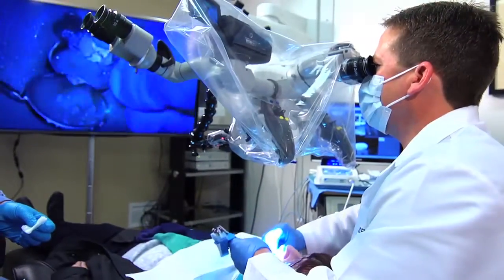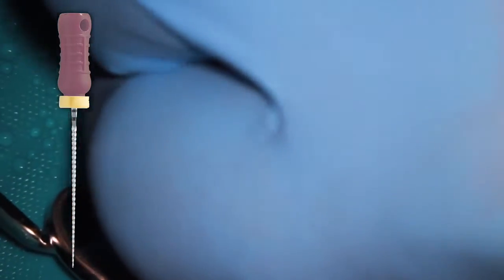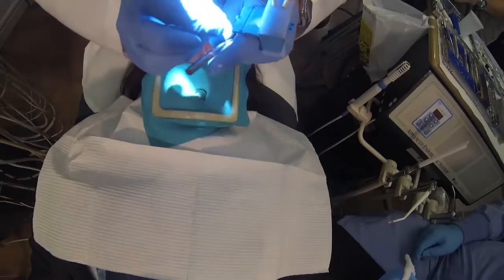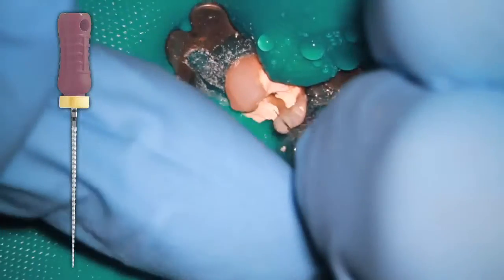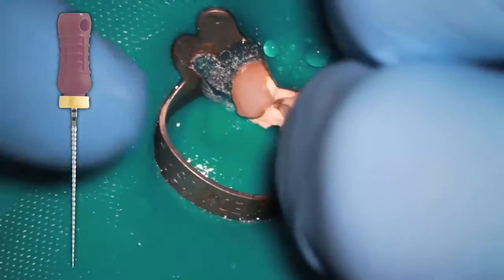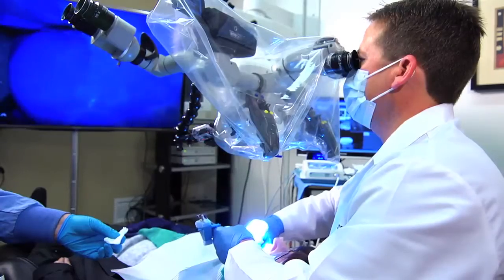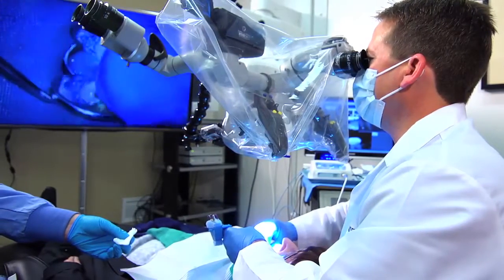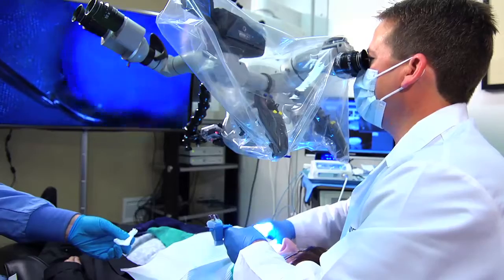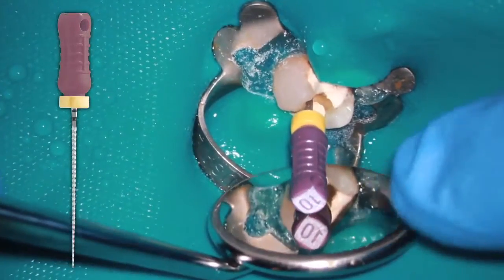Place some lubricant first into the chamber, just gentle, and I'm just going to put a couple of coats of it in so that we have some that we can work into the canal so our file's not working dry. So I'm just going to let some of this deposit itself. And now I'm going to approach the canal orifice. And now what I'd like to do is just very gently work that down, pull it back up, and again place it back down so that I have adequate lubricant at my tip.